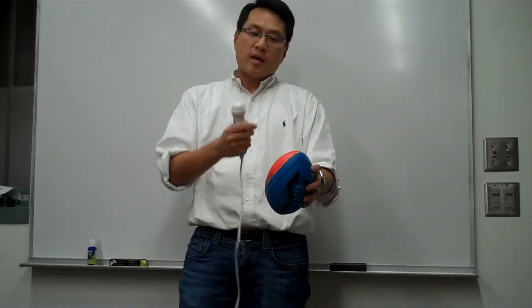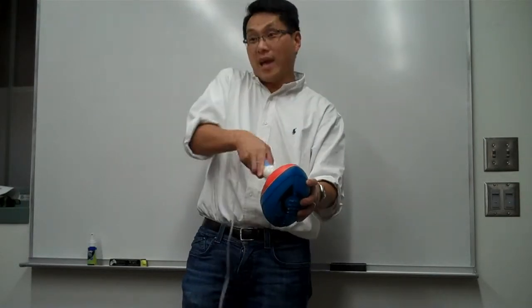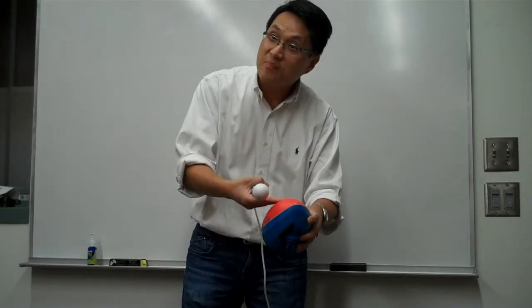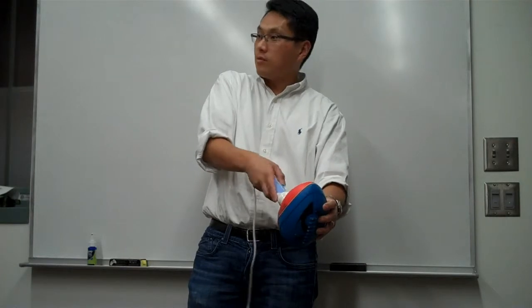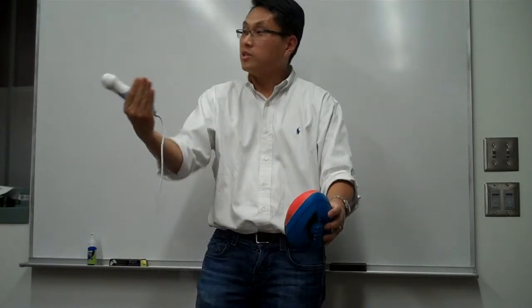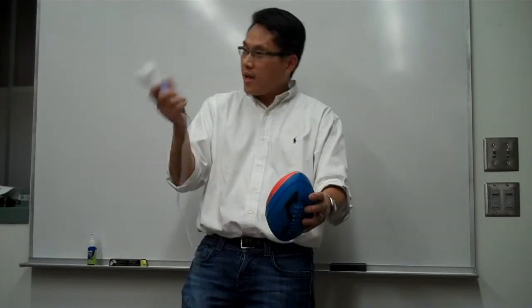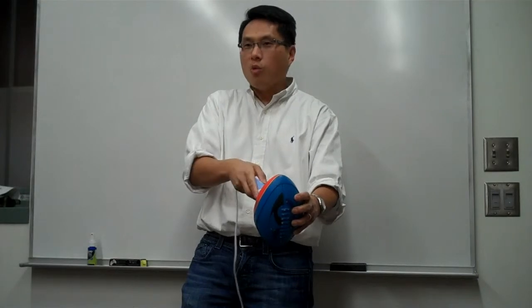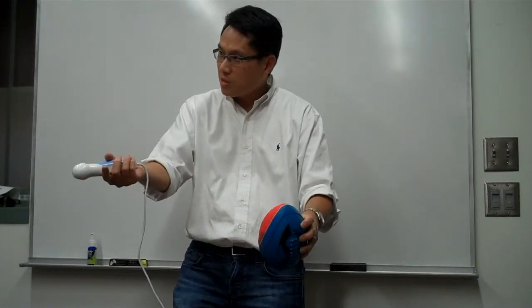If there was a way you could simulate a baby that you actually scan, so you know the baby's lying this way, and what you're doing is just playing with the probe, going from here, here, here, and you see how the image changes, then you can learn really fast what the effect of turning the probe is going to have on the image.